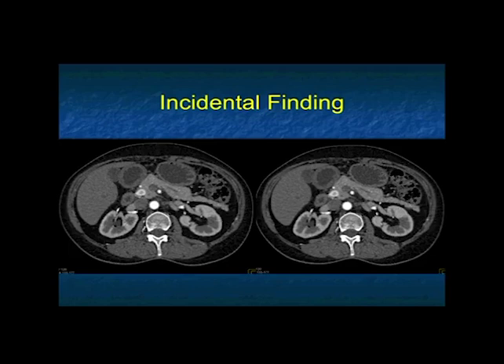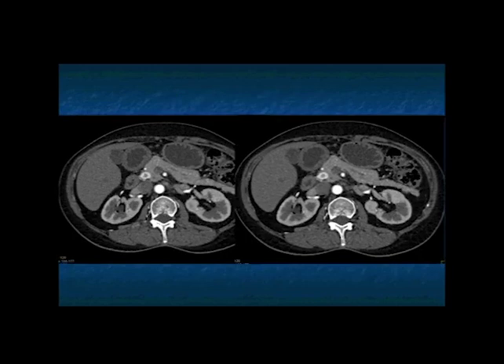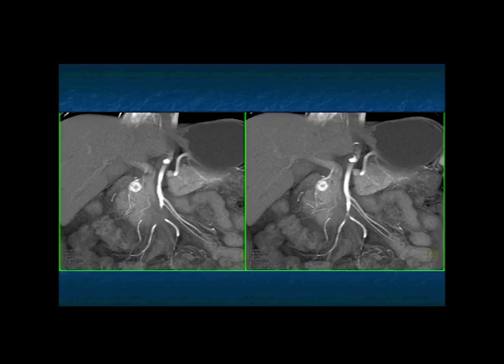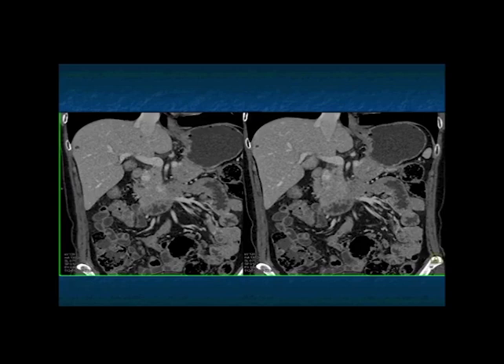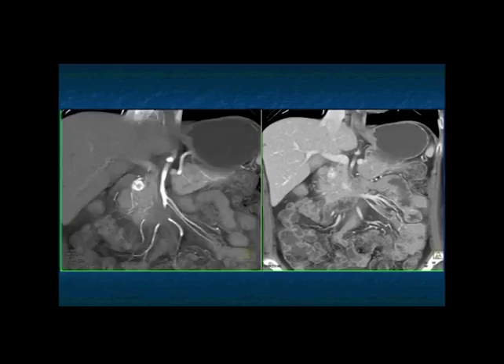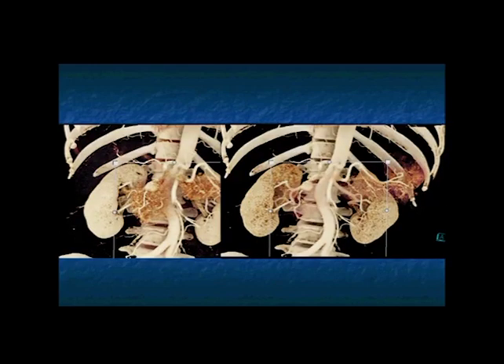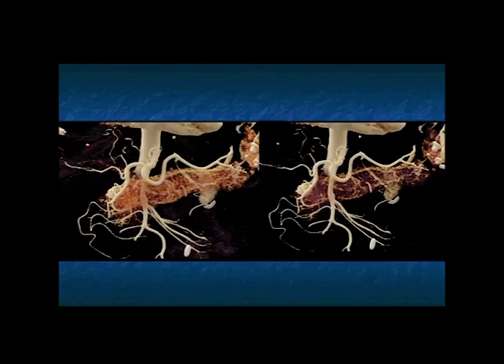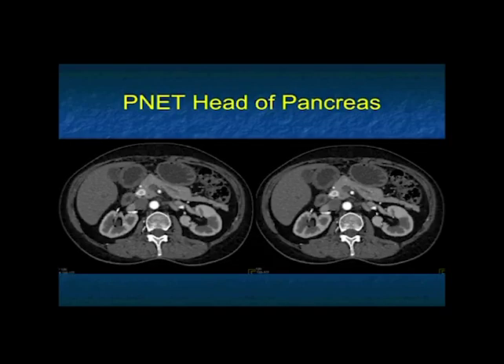Here is a more typical neuroendocrine tumor: one small lesion, hypervascular, head of pancreas — nothing very tricky. The lesion is very vascular. Metastatic renal cell carcinoma is a possibility, but the kidneys are present. You can see the feeding vessel — really classic for a neuroendocrine tumor. This case also shows nicely how neuroendocrine tumors wash out on venous phase imaging: still somewhat vascular but not as much as on arterial phase. The cinematic rendering shows tiny vascular lesions off the GDA going directly to the tumor.